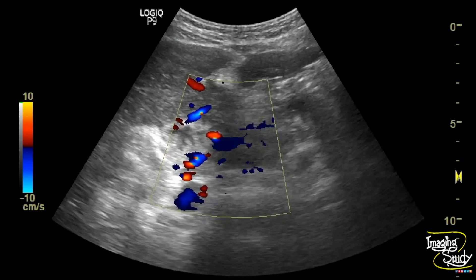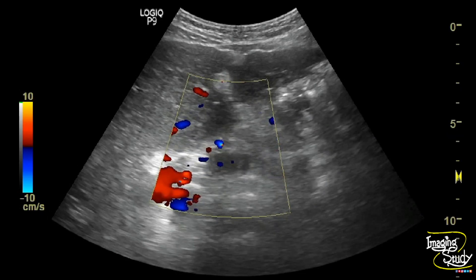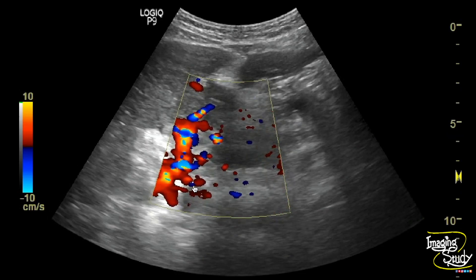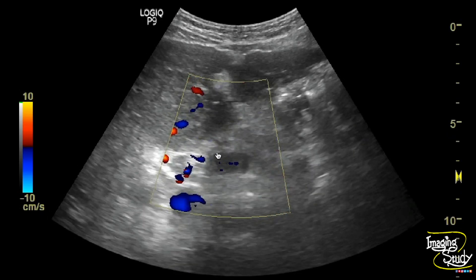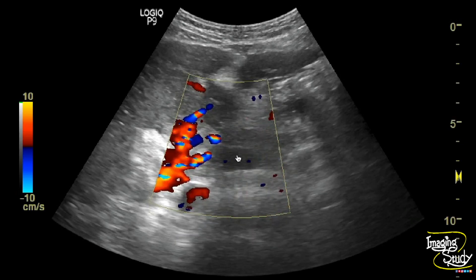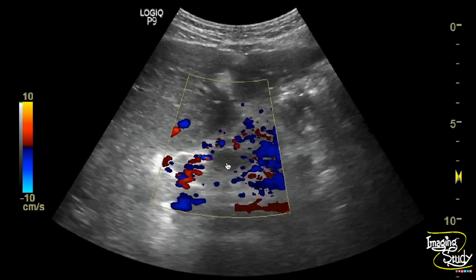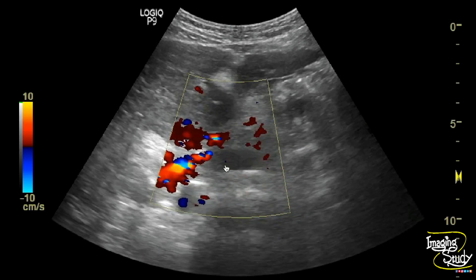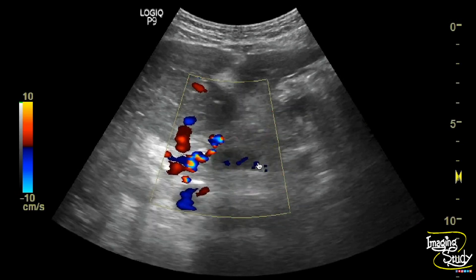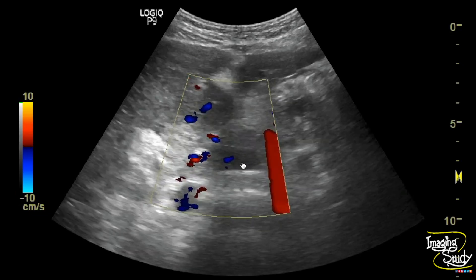Here with color Doppler you can see these aberrant tortuous vessels, and this is the splenic vein at the portal confluence showing no flow, indicating thrombus within the distal splenic vein.